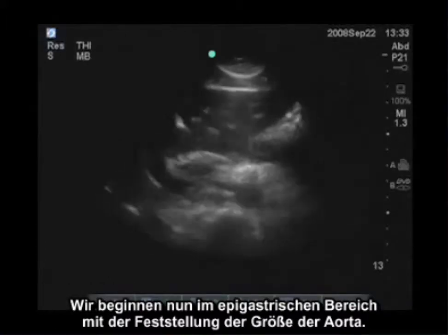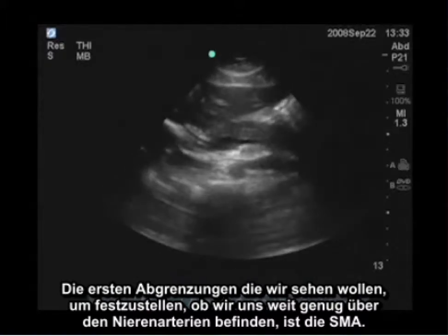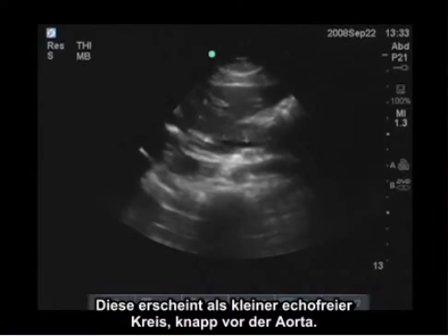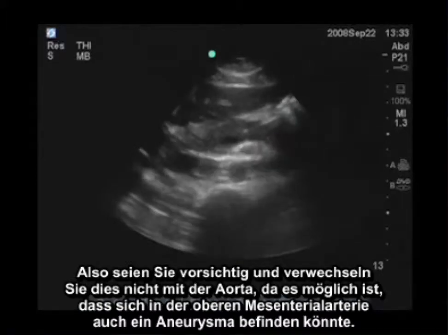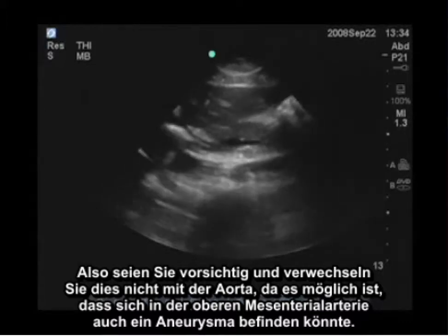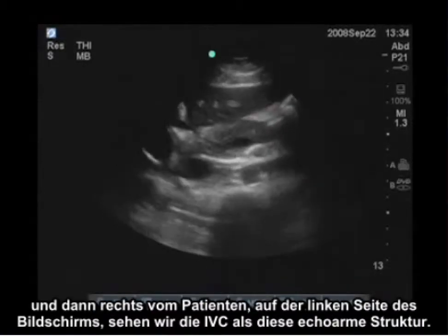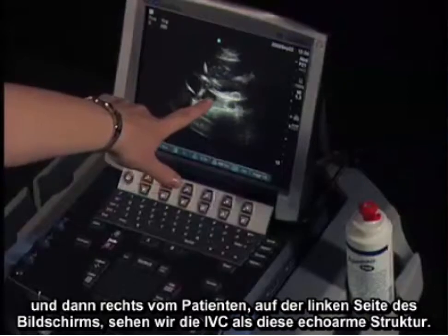We're going to start in the epigastric area assessing the size of the aorta. The first landmark we want to see — to know that we are superior enough above the renal arteries — is the SMA. This will appear as a smaller anechoic circle just anterior to the aorta. Be careful not to mistake it for the aorta, as aneurysm in the superior mesenteric artery is also possible. Immediately anterior to this is the pancreas, and to the right of the patient on the left of the screen we see the IVC as a hypoechoic structure.